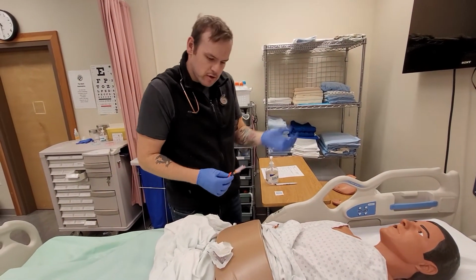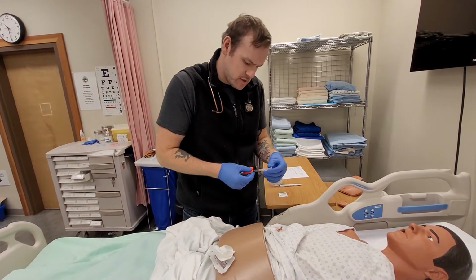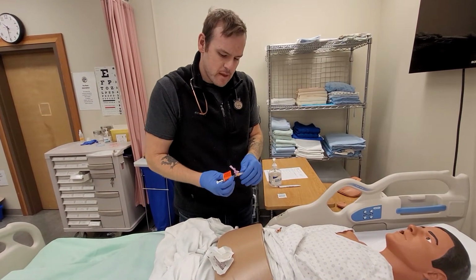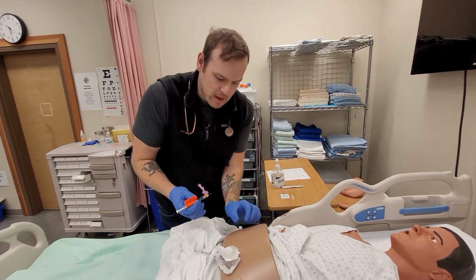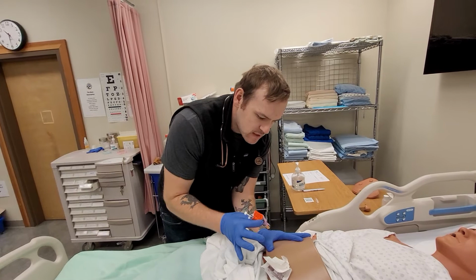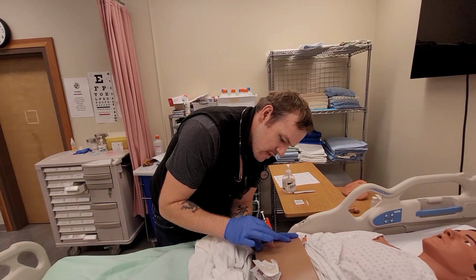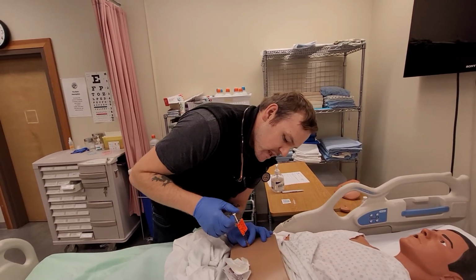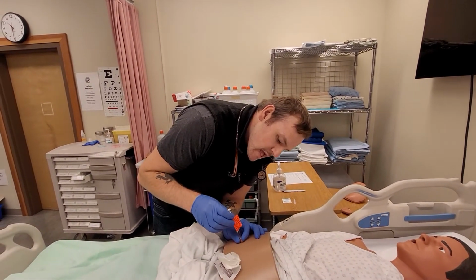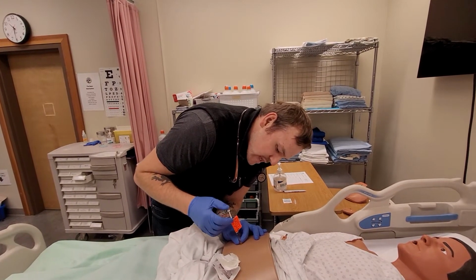So we've done all our checks. We've done our 7 rights. I'm going to go ahead and give this medication to you. Okay, Mr. Wilson? Okay. Perfect. So what I'm going to do is take the safety hub away. I'm going to pull the area taut around the skin. I'm going to use my dominant hand to insert quickly. Then I'm going to take my non-dominant hand, stabilize, and I'm going to inject the medication at a rate of 1 milliliter over 10 seconds.